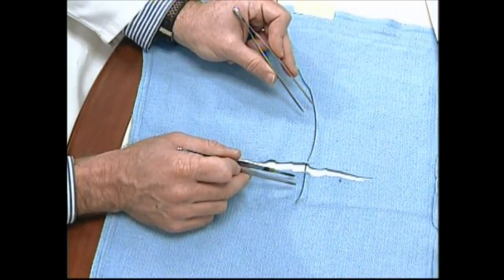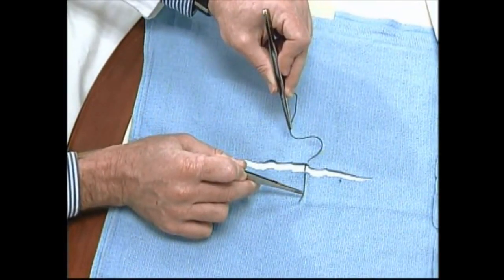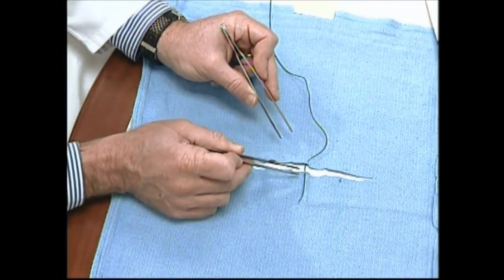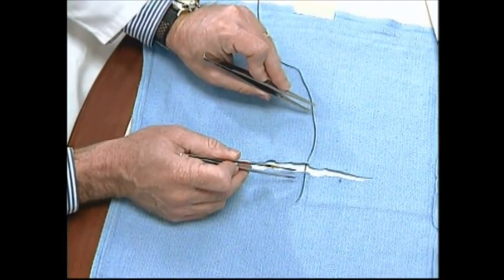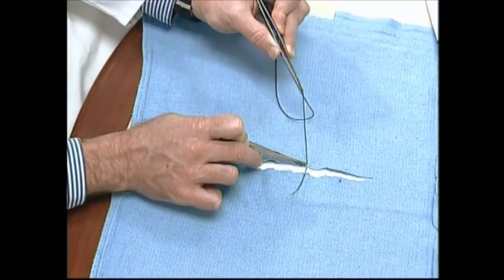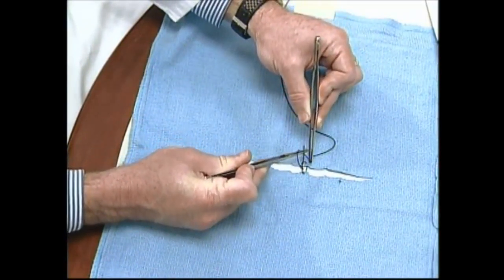Then we have to make the loop. If you happen to be using a jeweler's forceps, the jaws are very fine and can grasp the suture quite easily. However, if you are using a curved needle holder with larger jaws, this will cause difficulties in picking up the suture end and an alternate technique is necessary. For the traditional method: the left hand turns palm down and grabs the suture, forming a loop almost automatically. The right hand faces towards the tip of the suture, grasps the suture end, and makes the knot. The second knot is made without letting go of the suture end.